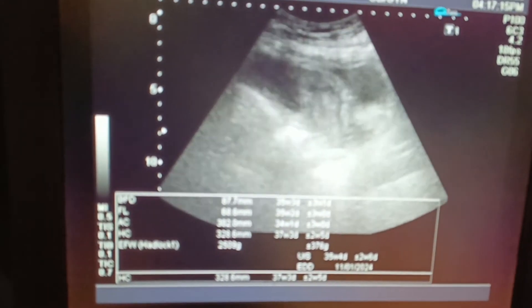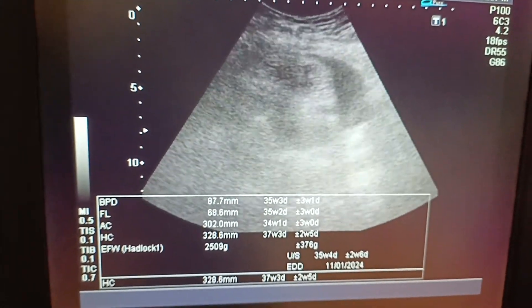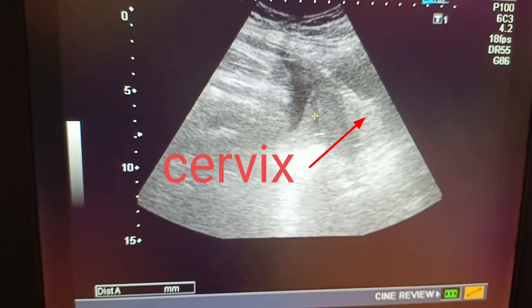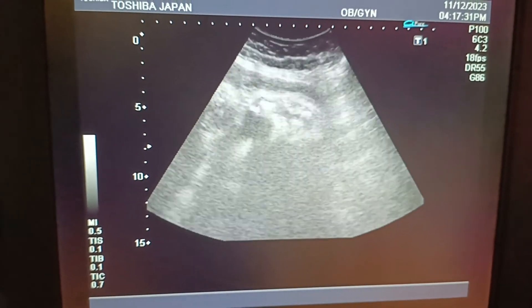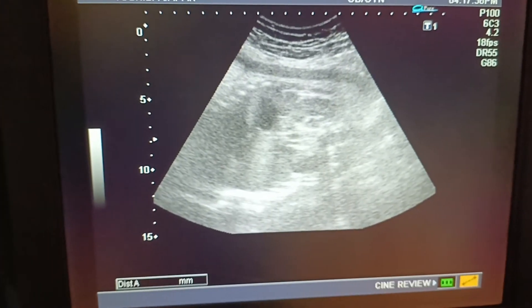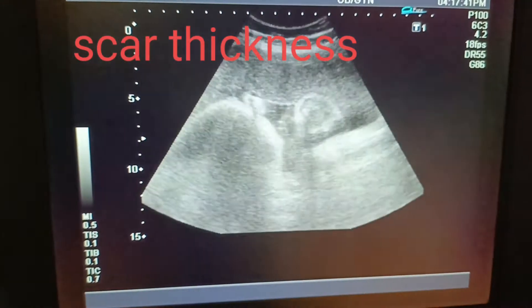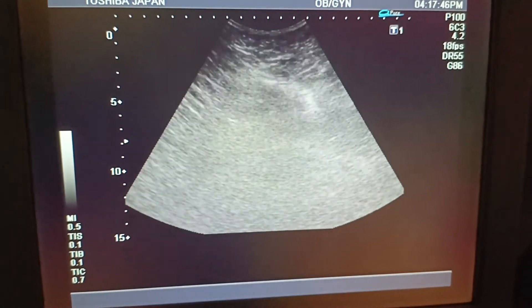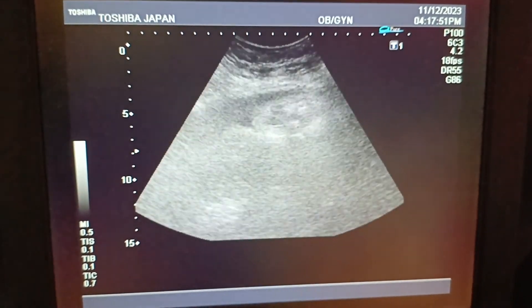The cervical length is about 4 centimeters. Now looking at the scar thickness in this case — it appears to be 6 to 7 millimeters. Normal is up to 3 millimeters, and if it is less than 2 to 3 millimeters we take it as a thin scar. The fetal parts are okay and there are no gross fetal anomalies.